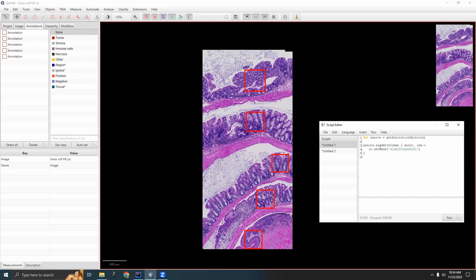So the way to use this eachWithIndex is you give the object you're looping over a name, comma, the index a name, comma, and then an arrow. And then instead of it, I'm going to type annot, and instead of setName, I'm going to type idx. But the indexing variable is an integer, and the name has to be a string, so we're going to convert it to a string with .toString. All right, let's run this. Control R. So it successfully gave everything a name. And they're named 0, 1, 4, 2, 3.